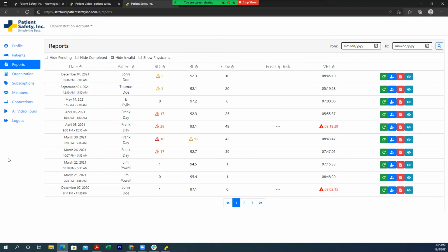Dr. Brian Chris asked, do you have a recommended protocol for titrating oral appliances? We do not have a default recommendation. There are some methods that have been tried and relatively true of setting a baseline with the device, with the SleepSat. Actually, if Amy is able to answer this in a more concise way.